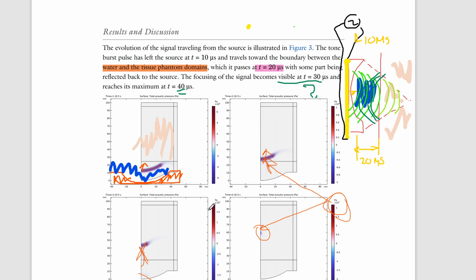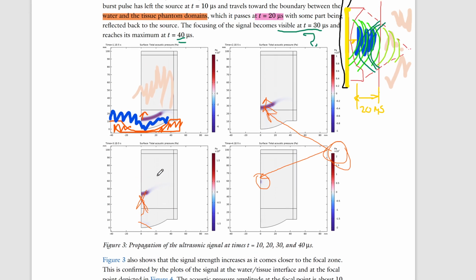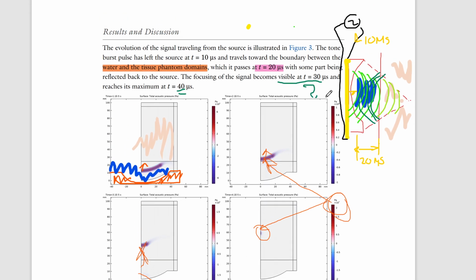It'd be nice to have some numbers attached to these because the color scale isn't that nice. Okay. But what we do know is that, hey, we can actually describe our model. Our model has a wave leaving our source here. It takes 10 microseconds for it to leave. Another 10 microseconds to cross the boundary. And then after it crosses the boundary, 20 microseconds to reach its maximum.